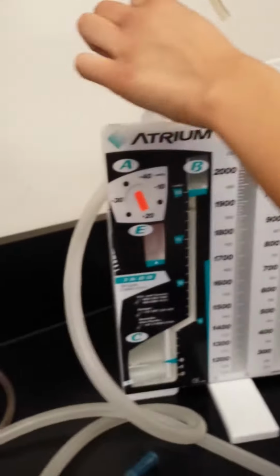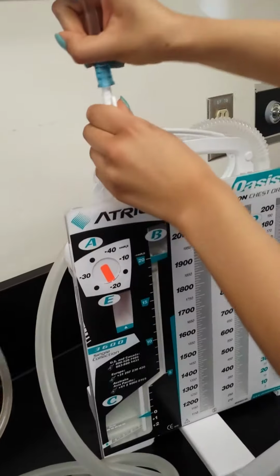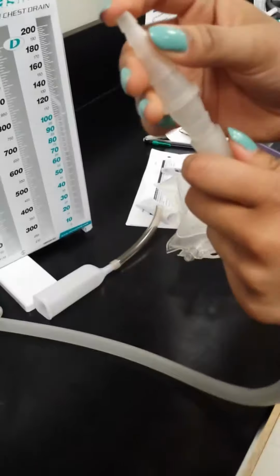Okay, so that's good. You filled it up. This after or leave it? I think you leave it open. Yes. And then you put the suctioning tubing on. Okay, that's good. The suctioning tubing's on. And then this other tube over here, you'd connect this to your patient. But you have to make sure everything is sterile. So before you connect it, you have to make sure it's sterile with the cap.